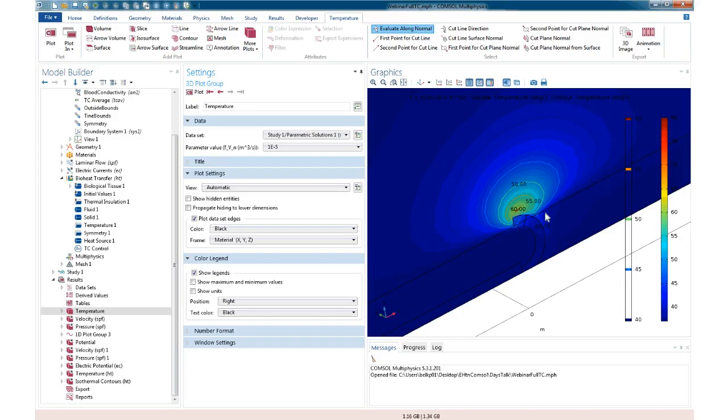But a lot of engineers didn't, because what's happening is I put in what I assumed was negative feedback. And my simulation has shown me that I wandered into a parameter space in which negative feedback turned into positive feedback. Why? Because the cooling effect of the blood operates differentially on the thermocouple more strongly than on the tissue. So now, the more cooling there is, the hotter and the larger this lesion becomes.